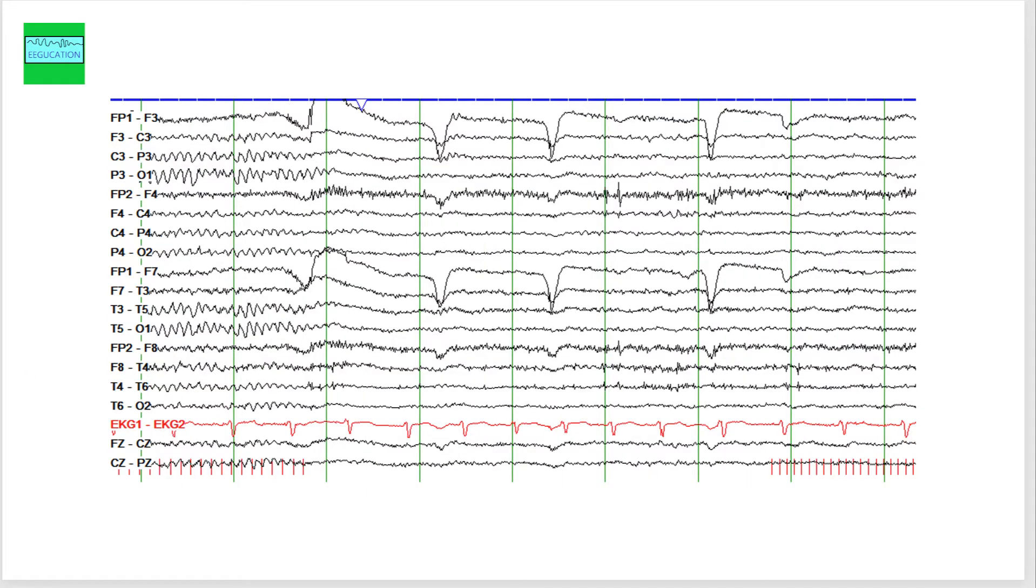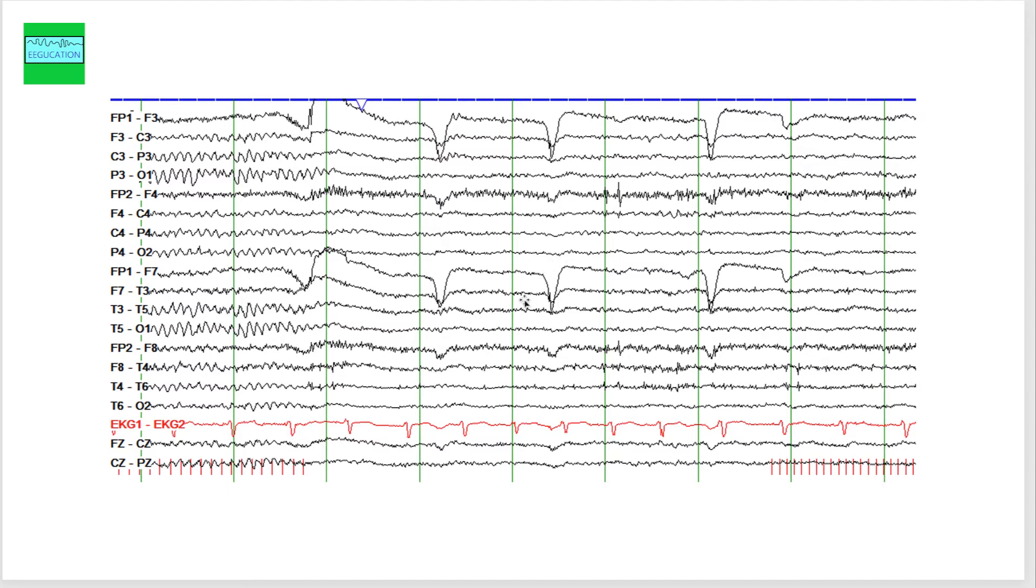This is another example. The person basically opens the eyes here, and then you see some blinking, but the blink artifacts are only seen on the left side and not on the right side.